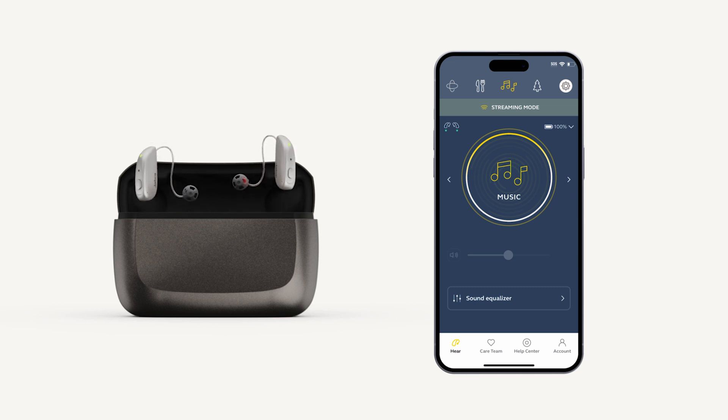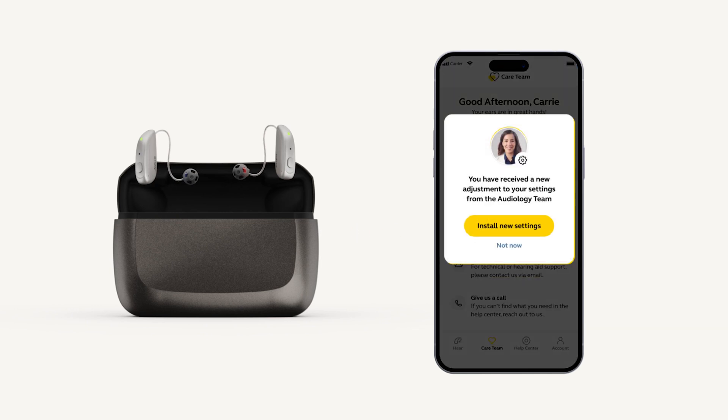While your hearing aids will always function as hearing aids, pairing to the Jabra Enhanced Select app is super important. The app will allow you to communicate with our care team, submit remote requests, and serve as a remote control for your hearing aids.